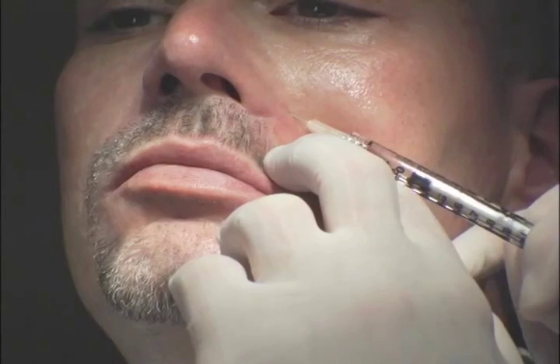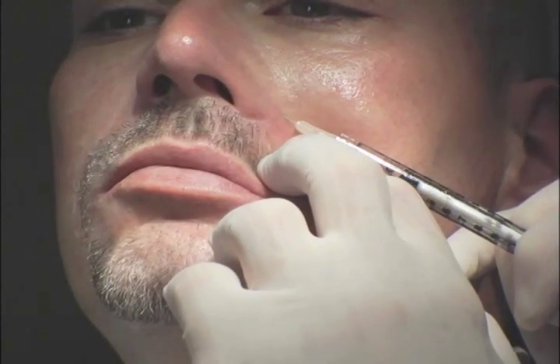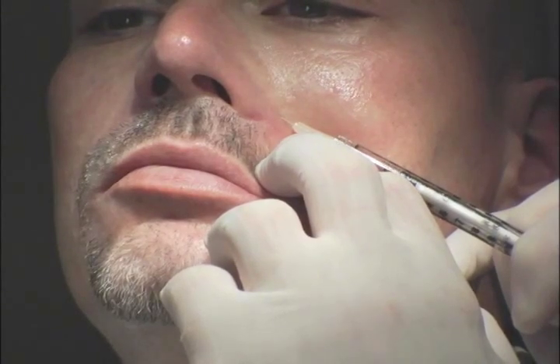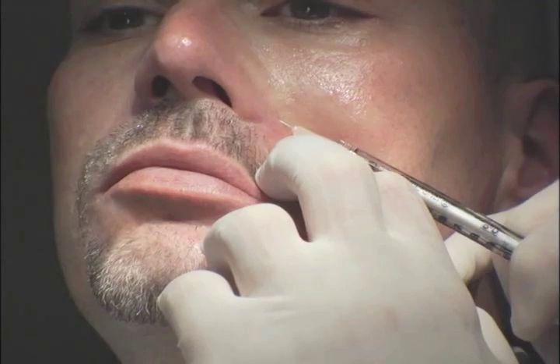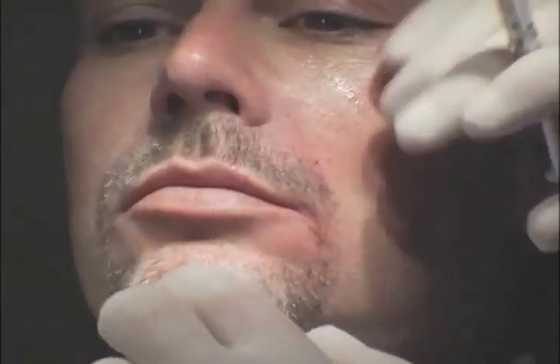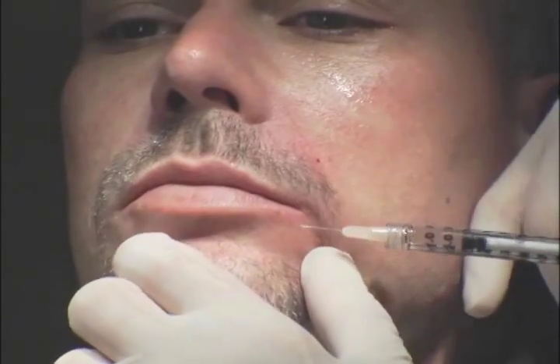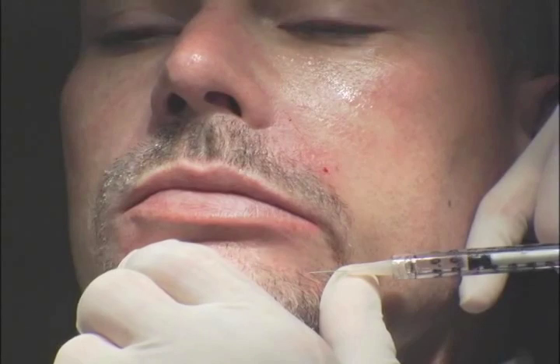Years ago, plastic surgeons always liked to preserve this angle around the nose. And then when I started using fillers, even back in '79, I always started getting rid of it because I noticed in younger people they didn't exist, these shadows around the nose. I see a little bit still this dent here. You see that? Yeah. So let's put a little layer more, a little bit more right here, and that'll be it.